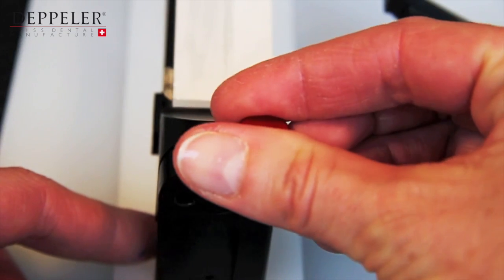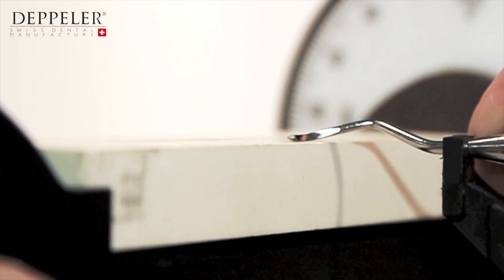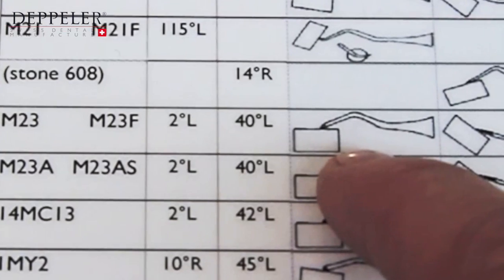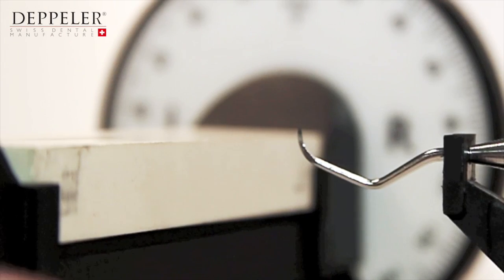Check that the angle you have adjusted corresponds to the cutting edge you want to sharpen. With this adjustment at 2 degrees, you have to lift the instrument to be able to put the blade on the stone.